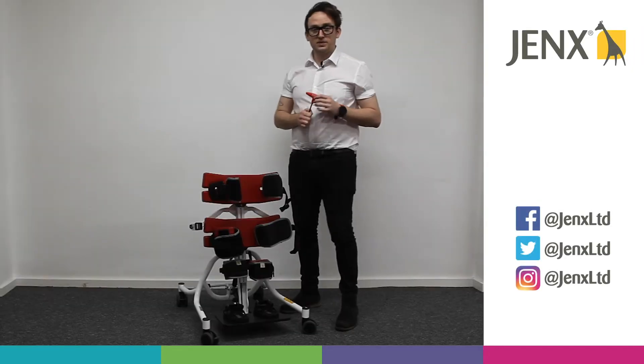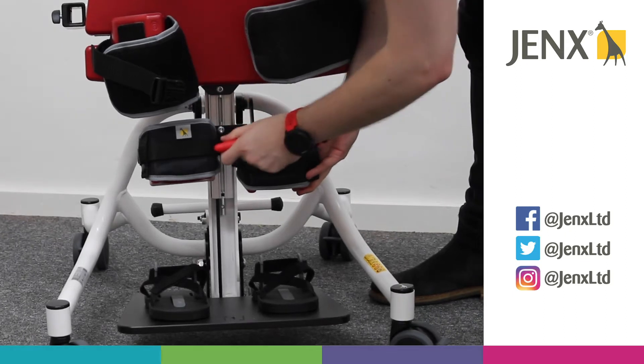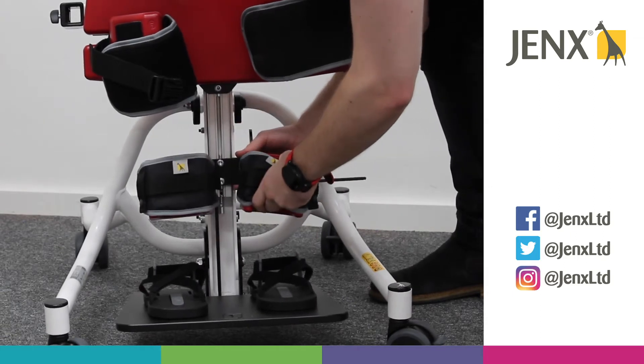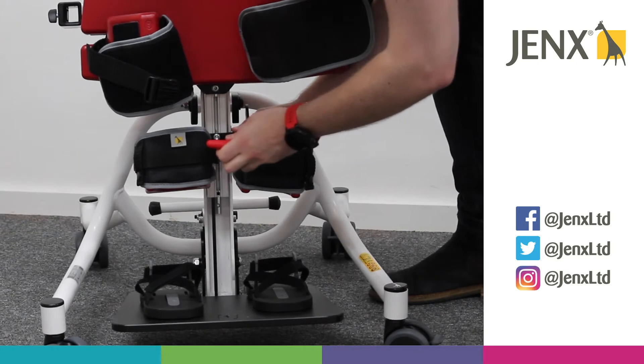For adjusting the knee cups, if we want to change the height, we've got two Allen keys here, so we can lower that to wherever we need it to be. Once we've found the spot we want, just tighten those up.